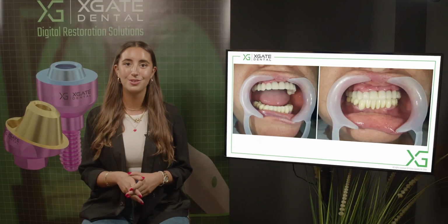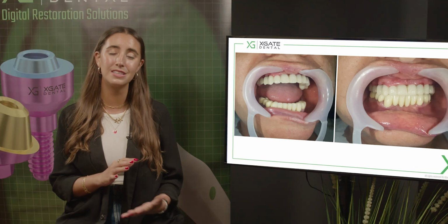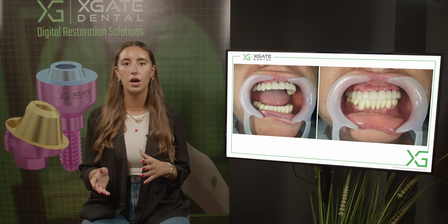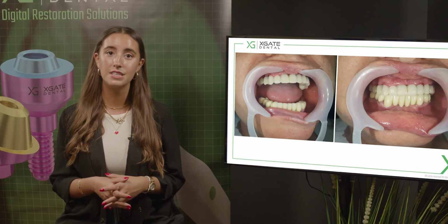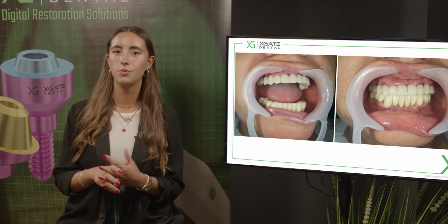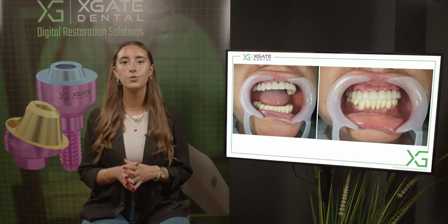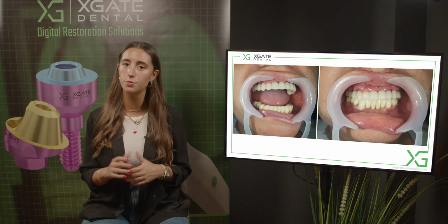This is the bridge. You can see that the picture was taken after it took some time to heal, and the gingival color is somewhat better. You don't see all of the blood and the inflammation that was there before because of the surgery. The relations are the same as they were before, and this was taken about a week or so after the operation. You can still see that there's no complete healing of the gingiva, but everything is much better.